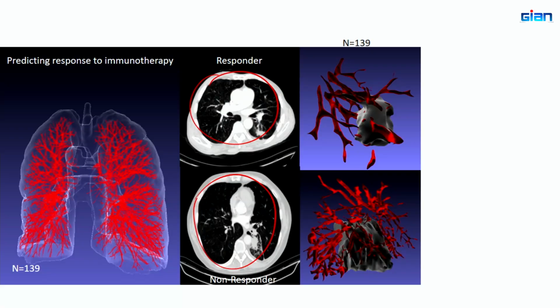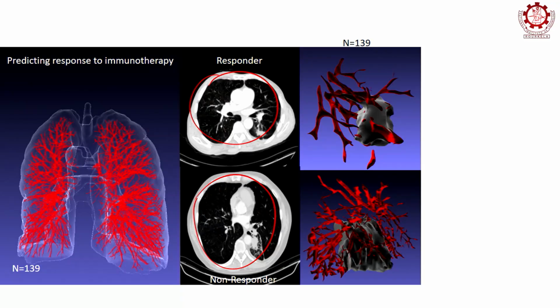Now, if you remember the brain tumor image that we had, you saw that tumor and then you saw some necrotic region, enhancing region, and the peritumoral region. So that looked like one blob, right? But here, if you look at the blood vessels on the screen, it appears so complex, right? It's a tree-like structure. There are probably tens of thousands of voxels. I mean, since this is 3D, instead of pixels, these are voxels.